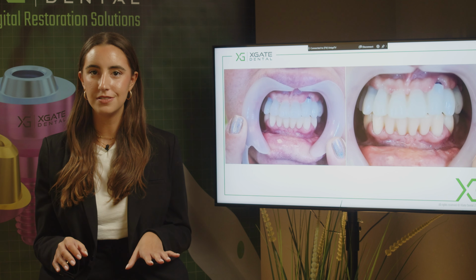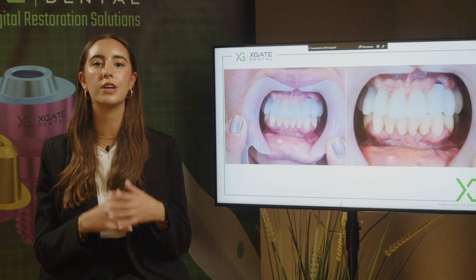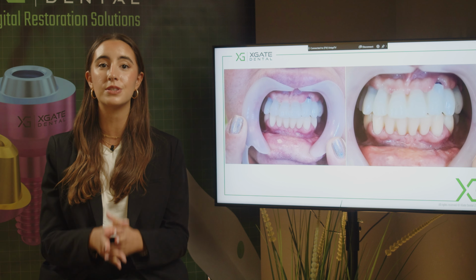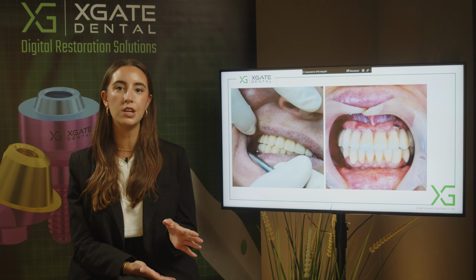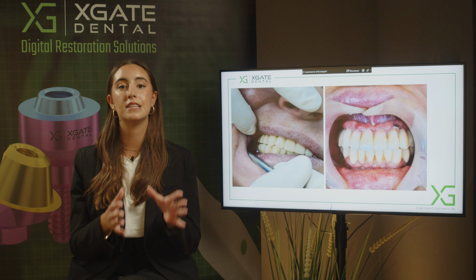We made a lot of versions because each time the patient had a complaint, and we wanted to show her that we can do and we can achieve anything that she needs. Up until the final version that we made from zirconia with cemented sleeves, we added a little bit of color to see better the separation, and we changed the lower bridge also to zirconia so you can see the central line is in the middle.